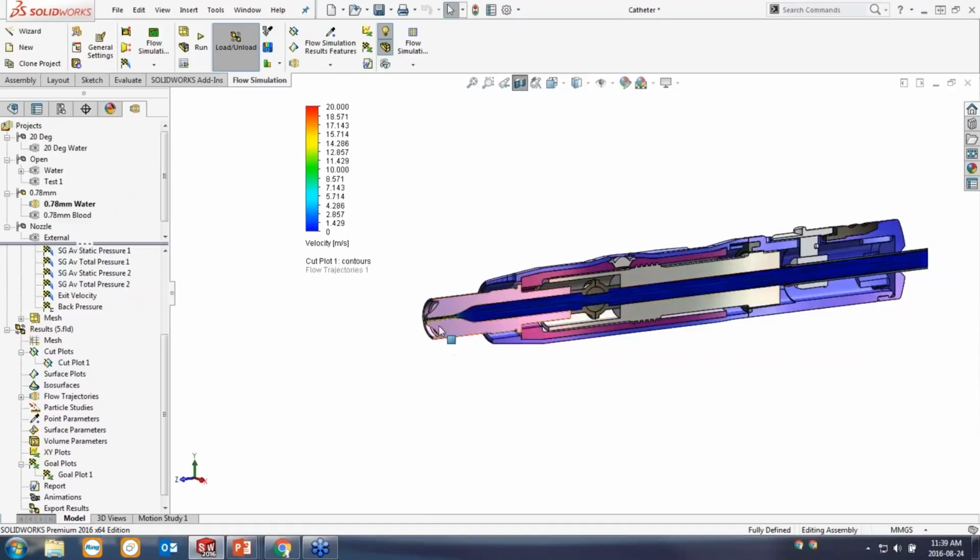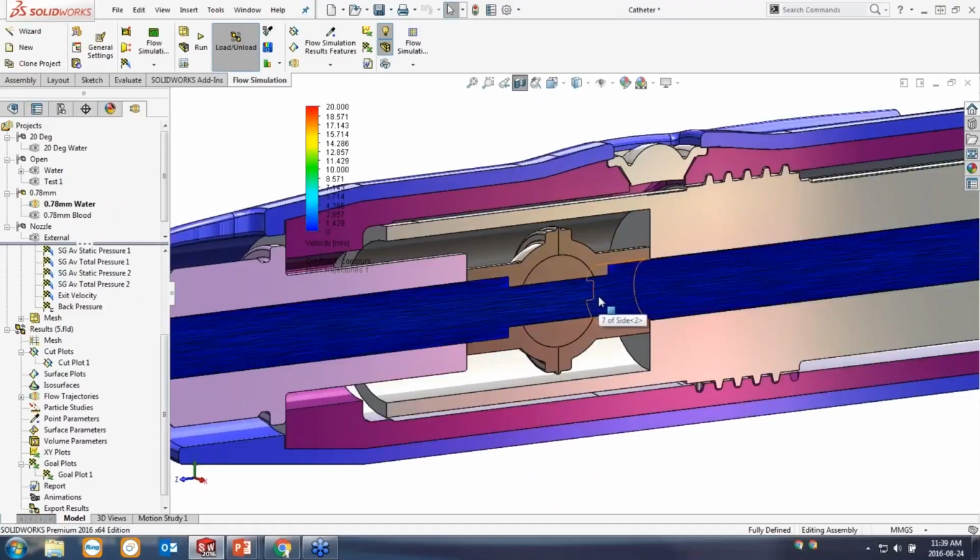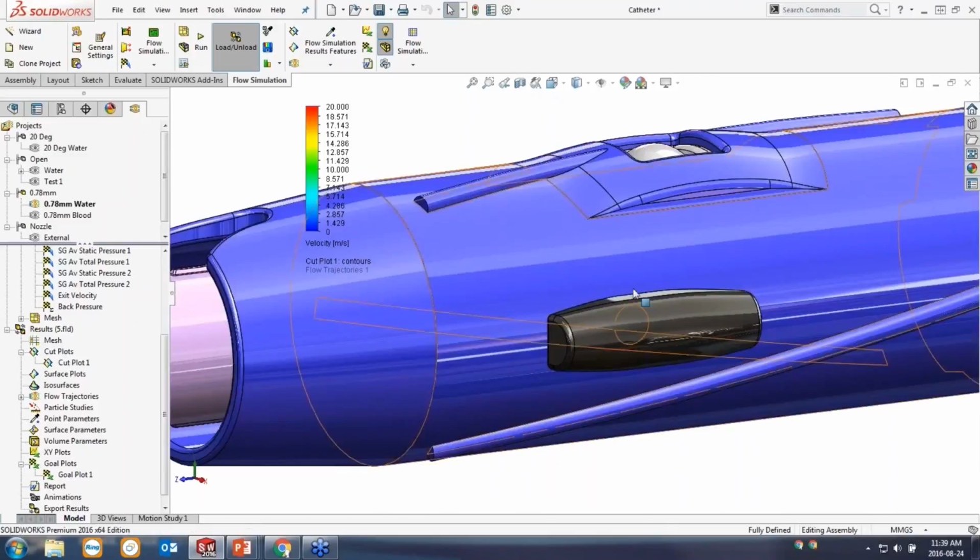Now, that was my first area of concern. My other area of concern was the valve position, and up till now we've just left it fully open. And what I'm concerned about is, this is a user-operated device. They crank the handle, that opens the valve, or they can set it to close. What if they don't manage to open all the way, or they only have it halfway and the fluid starts flowing out? Is that going to have a bad effect on the exit characteristics of the fluid?